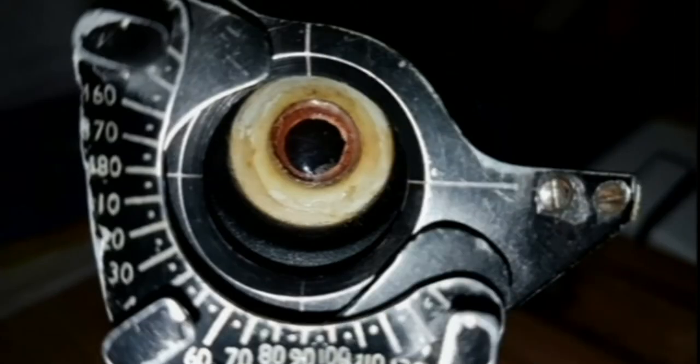Initially there are some model eyes, because you can't practice on a patient, very simple ones costing about 3,000, 4,000 rupees. You can do the retinoscopy, you can see the fundus, everything in this model eye. So this is very good.